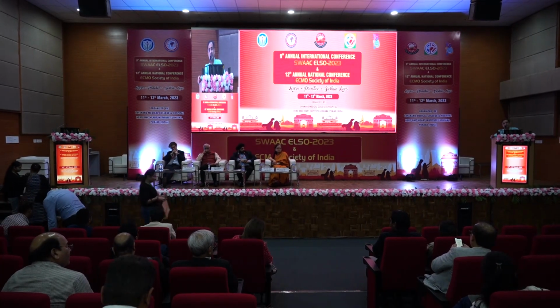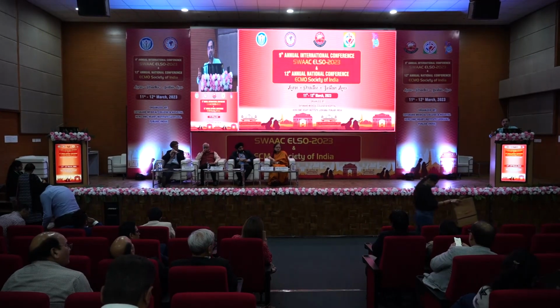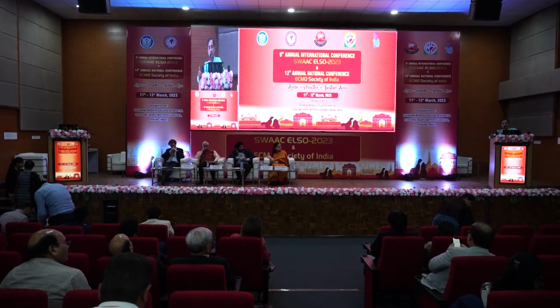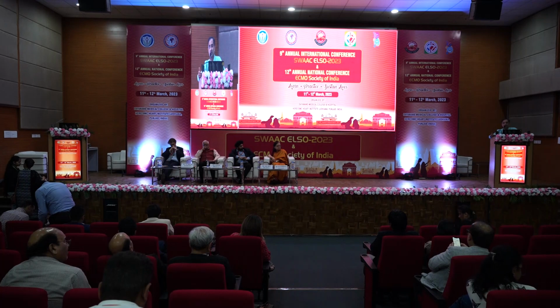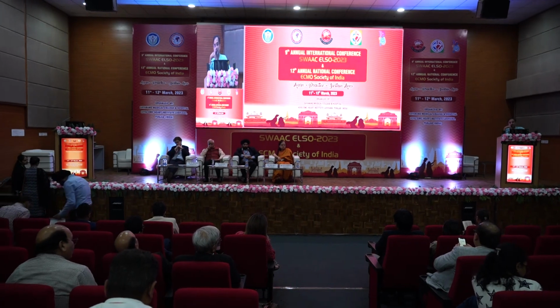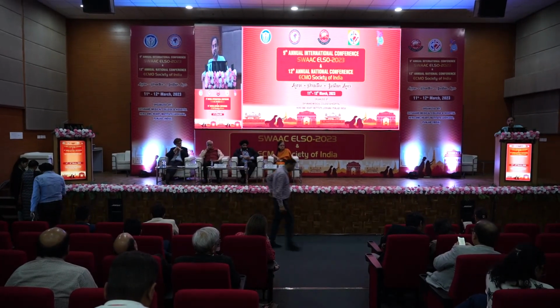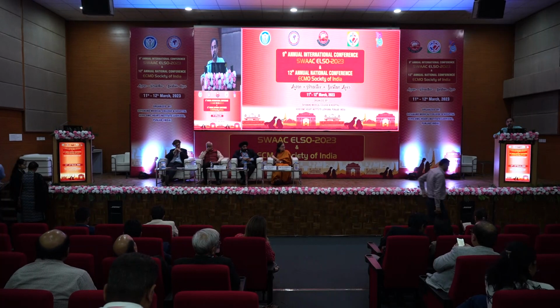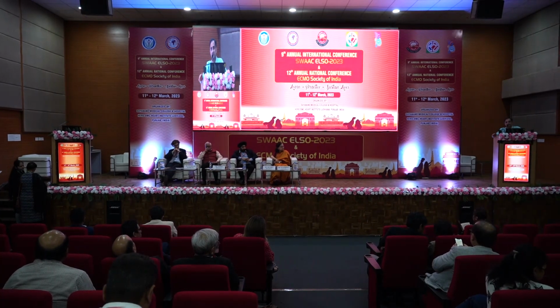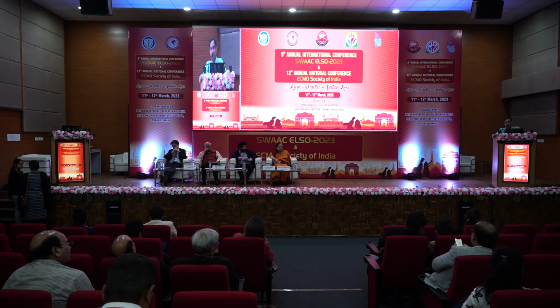That's one part. The second part is when you are on ECMO, there is no pressure of maintaining the gas exchange. So the whole focus would be on how to recruit the lung better, how to ensure the advantages of proning in terms of the pathophysiological positive changes that happen. So there is clinical data to say that it does help even in that scenario.